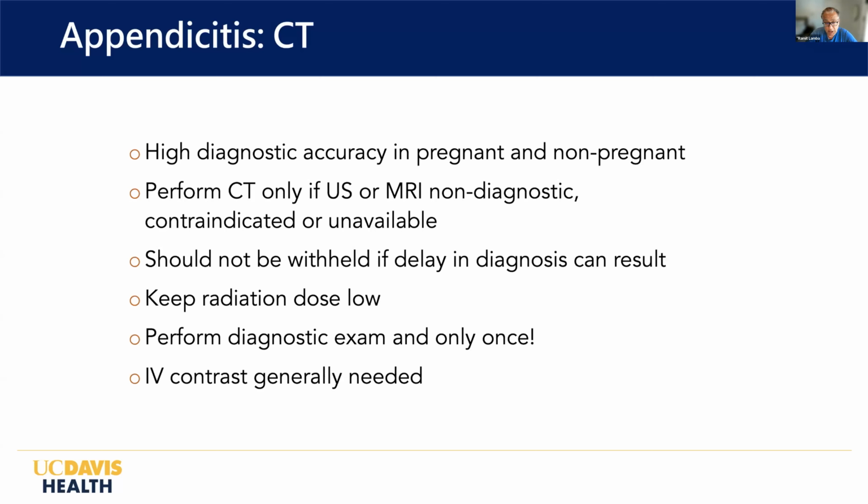If you're going to do a CT, then it is best to get a diagnostic exam, so you're getting an exam only once. So IV contrast should almost always be used.